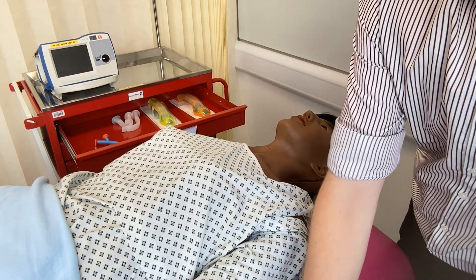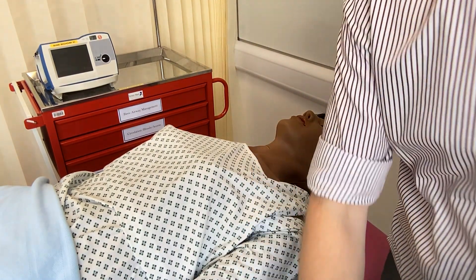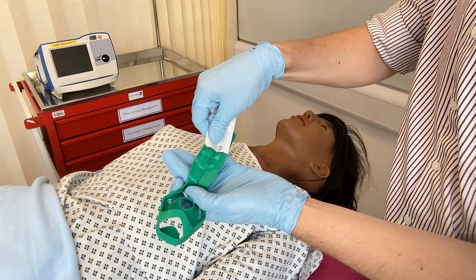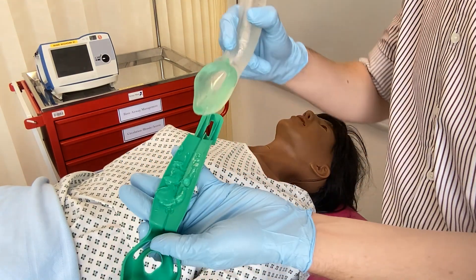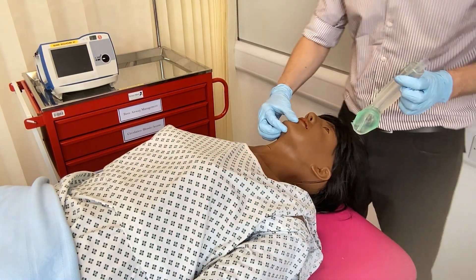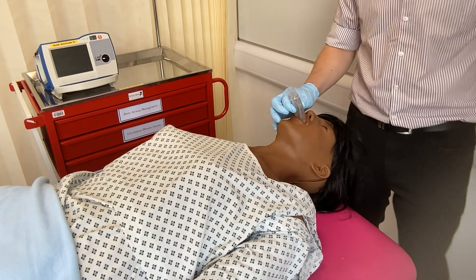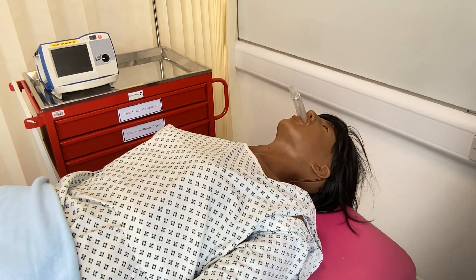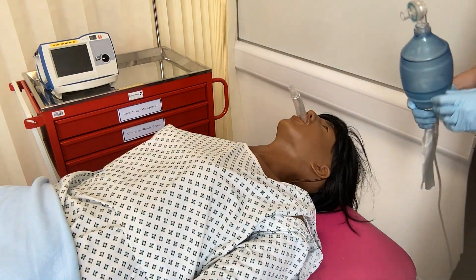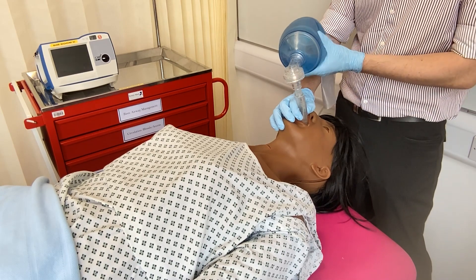First, remove the device from the packaging. Next, lubricate the underside and the tip of the device. Tilt the patient's head back, if able to do so, and open the mouth. Insert the device by running the underside along the hard palate — no rotation is required. There is a black line which should line up with the teeth when the recommended insertion depth has been achieved. Once inserted, attach the device to a BVM by removing the face mask on the BVM first, or to a ventilator. Finally, secure the device with tape or ties.